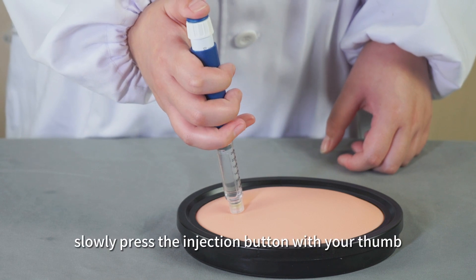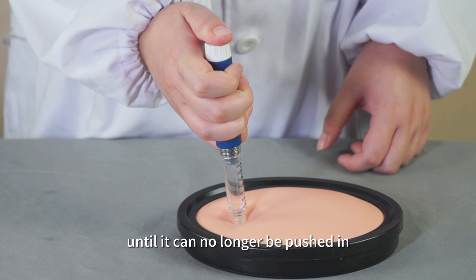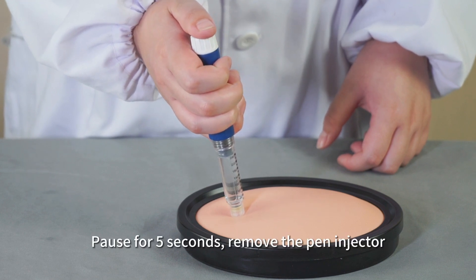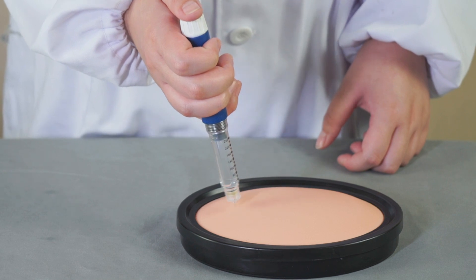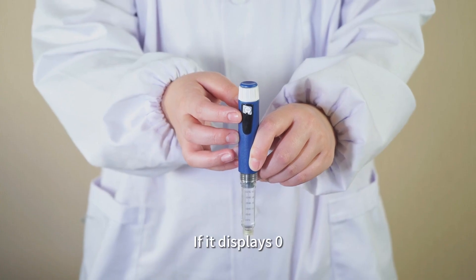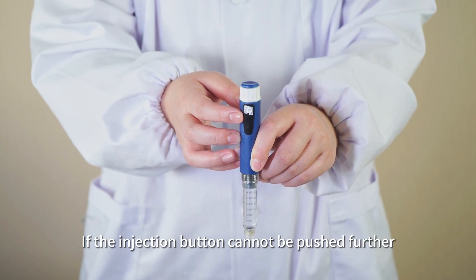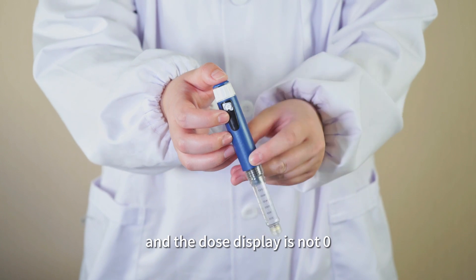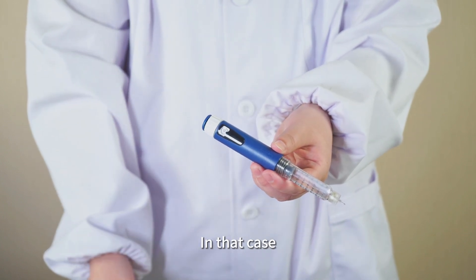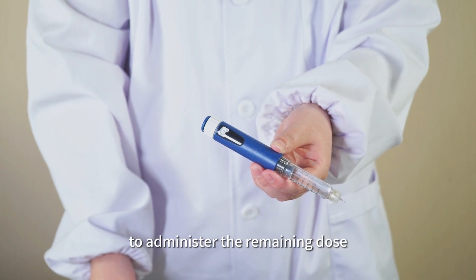Insert the needle. Slowly press the injection button with your thumb until it can no longer be pushed in. Pause for 5 seconds, then remove the pen injector. Check the dose window — if it displays 0, it means you have injected a sufficient dose. If the injection button cannot be pushed further and the dose display is not 0, it means you have not injected a sufficient dose. In that case, please replace with a new pen cartridge to administer the remaining dose.